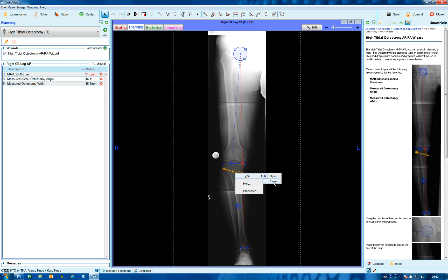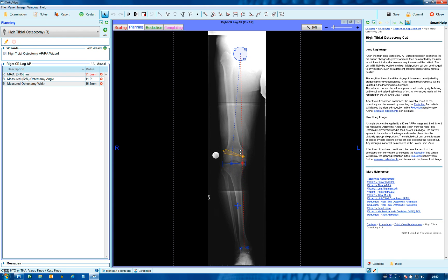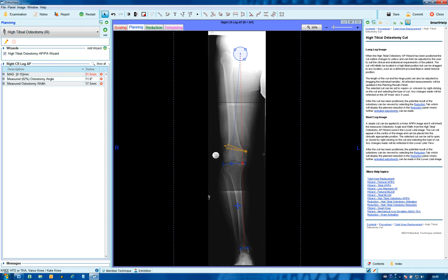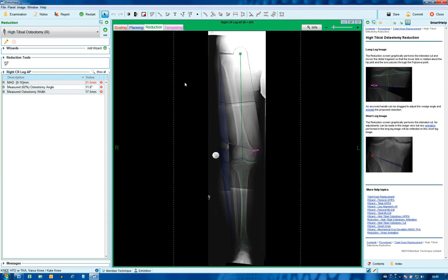An alternative method is to use a closed cut in the distal femur. Right-click to obtain the properties and choose 'closed' — this will turn the cut, and then it can be positioned appropriately in the distal femur.